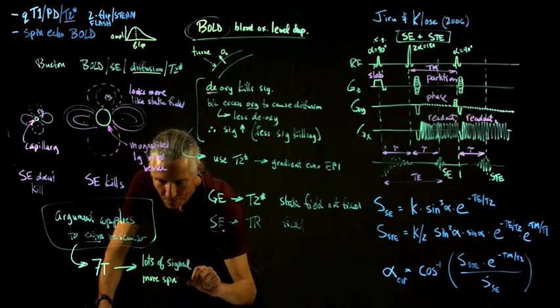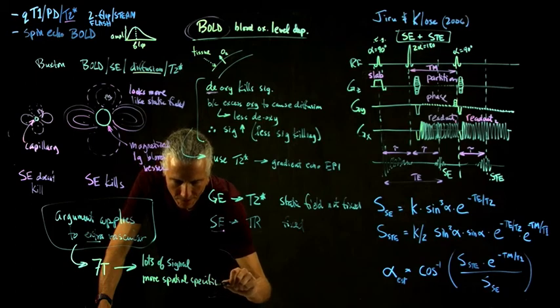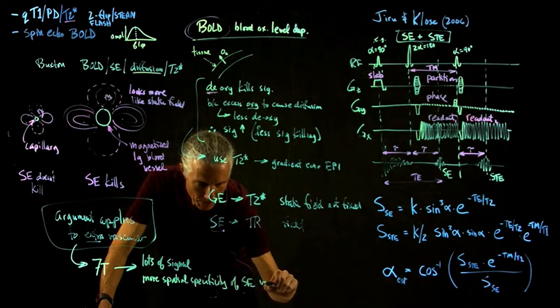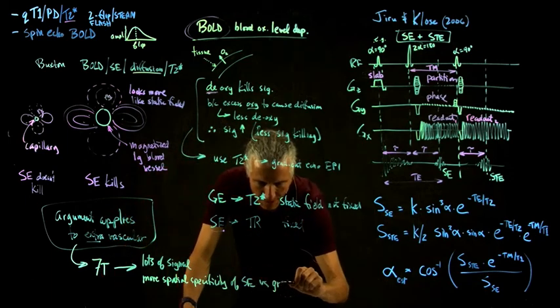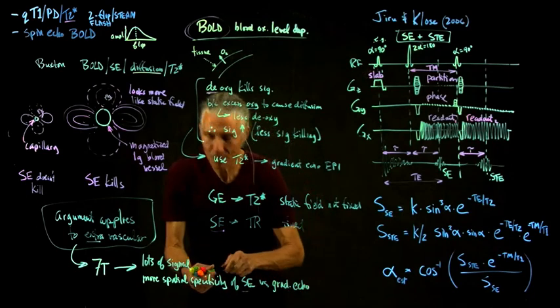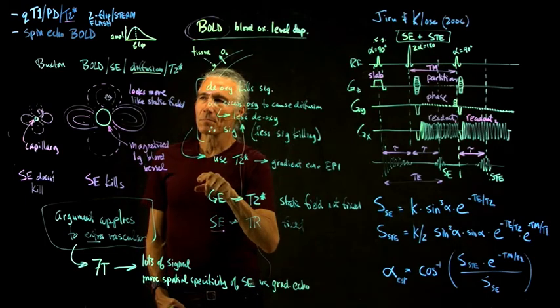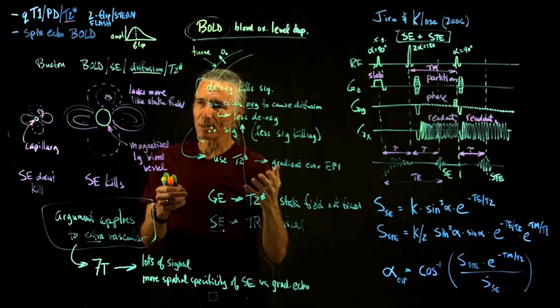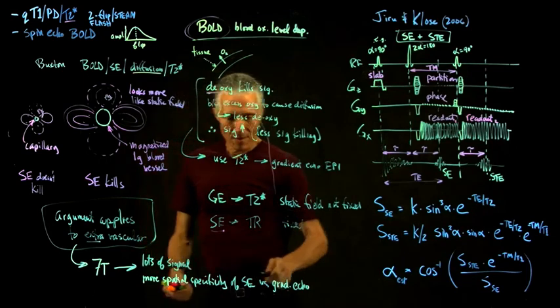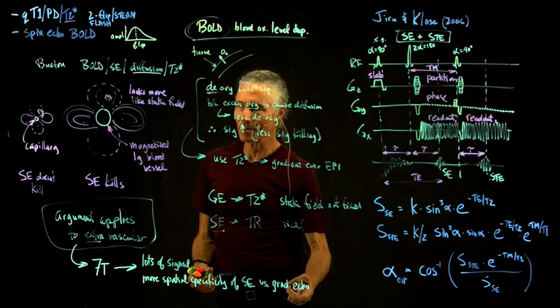And what you can see is more spatial specificity of spin echo versus gradient echo. If you go someplace where there's a visual map and look at the specificity of the visual map, which we know is there from a lot of experiments in animals, you can see that you have a finer representation of the visual map with the spin echo signal instead of the gradient echo.